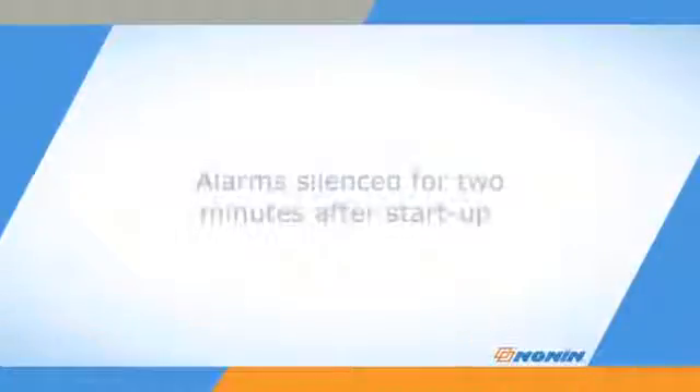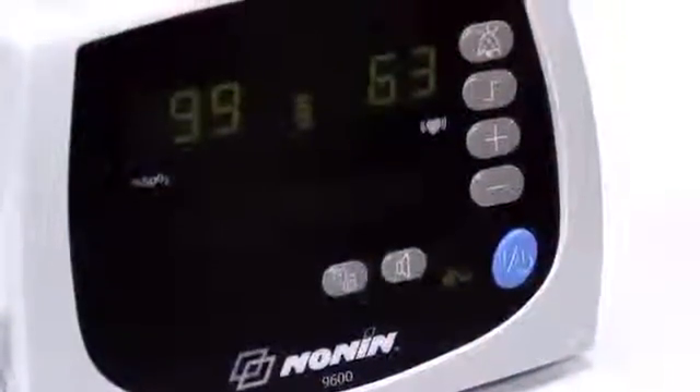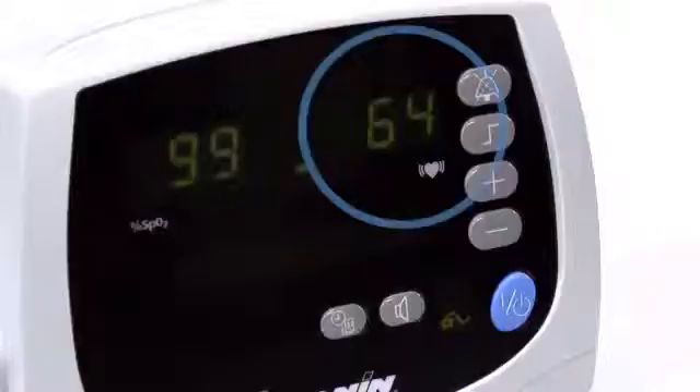The alarms are silenced for the first two minutes after starting the unit to allow time for adjusting settings and connecting the sensor to the unit. The oximeter will start displaying and recording SpO2 and pulse as soon as the sensor is placed on the patient. The SpO2 level is shown on the left side and the pulse rate on the right side.